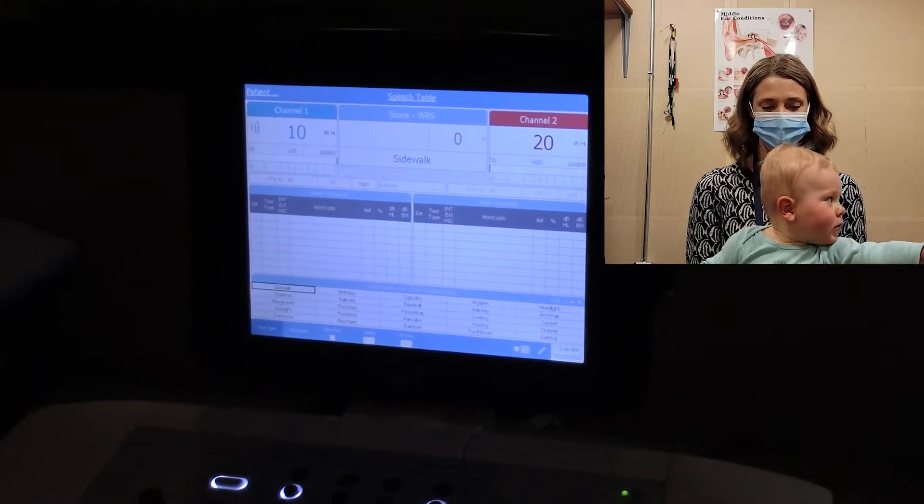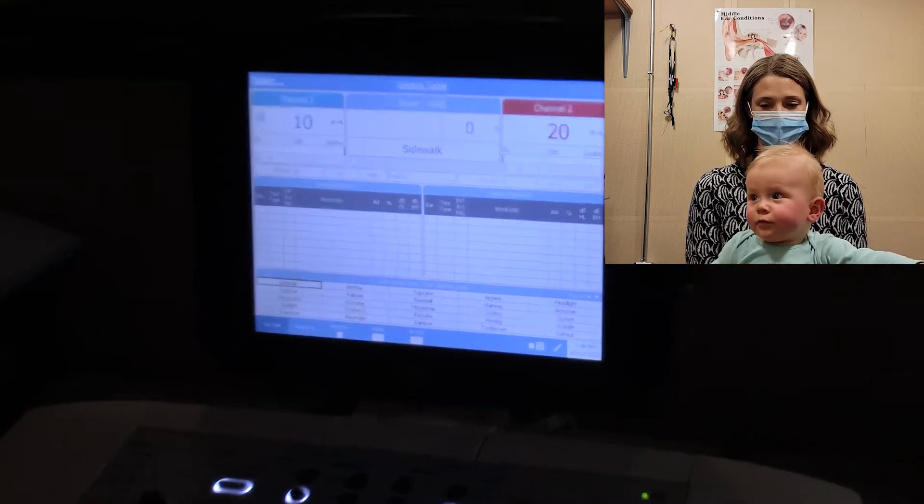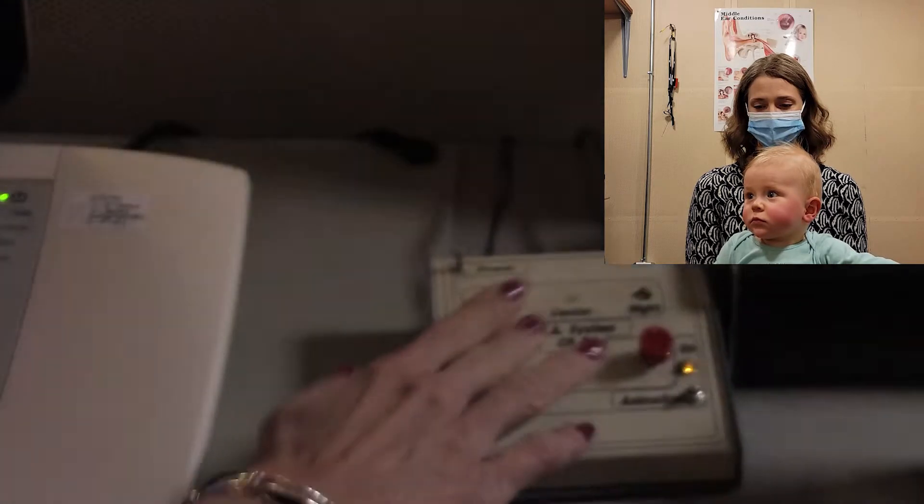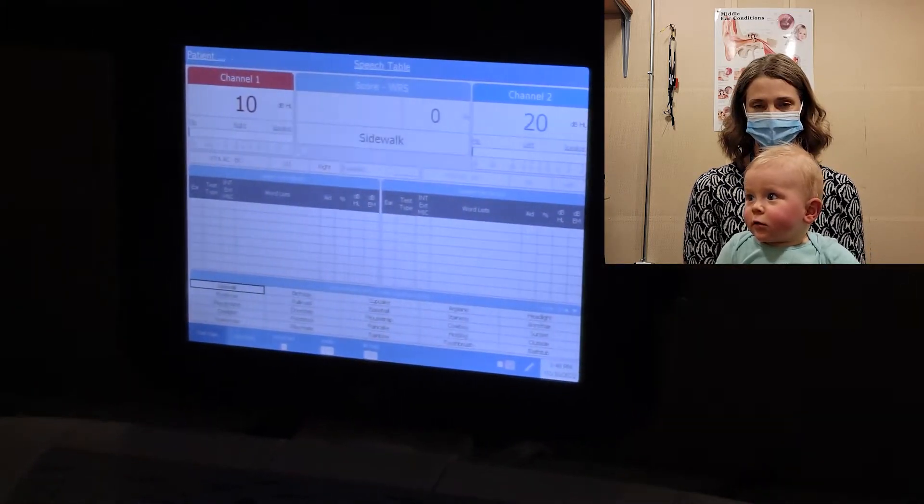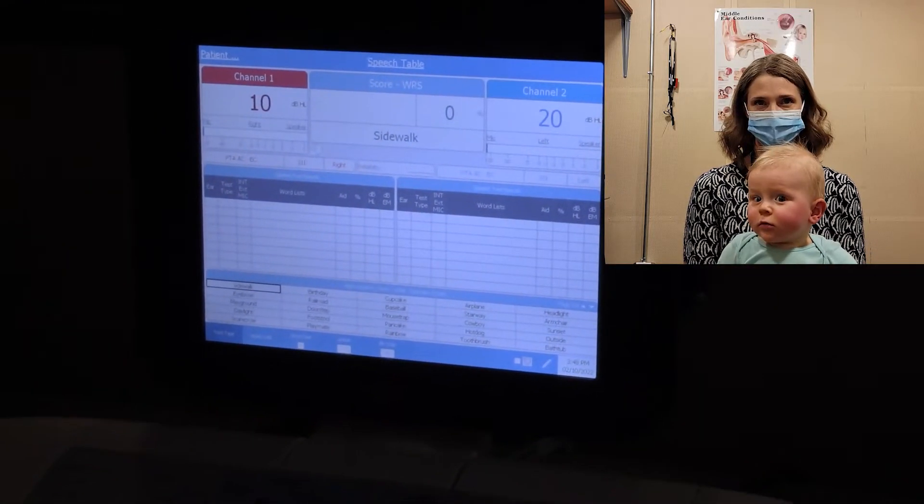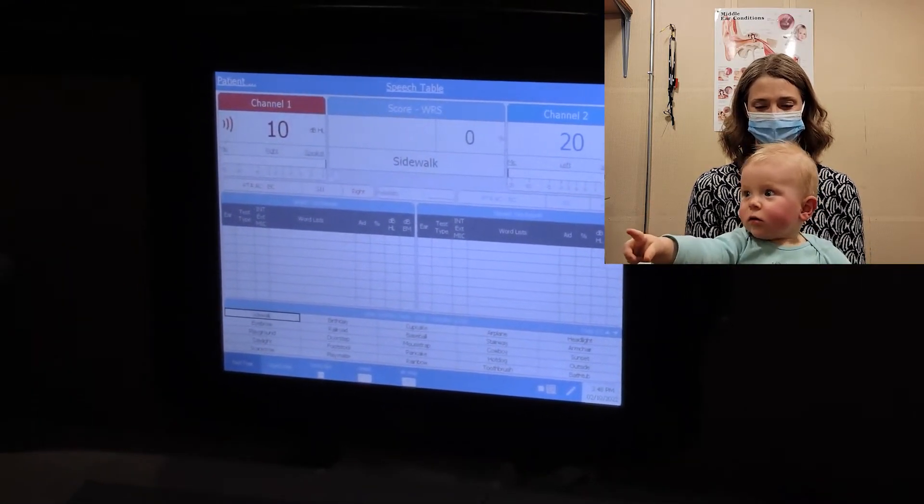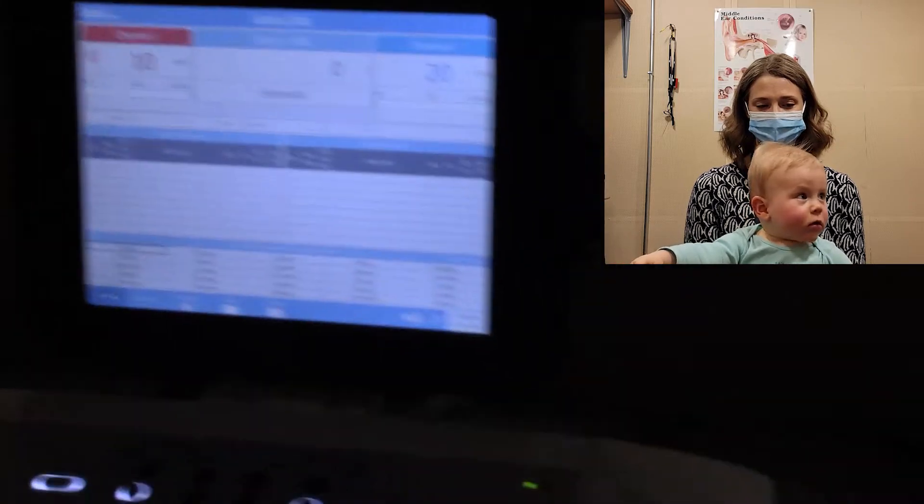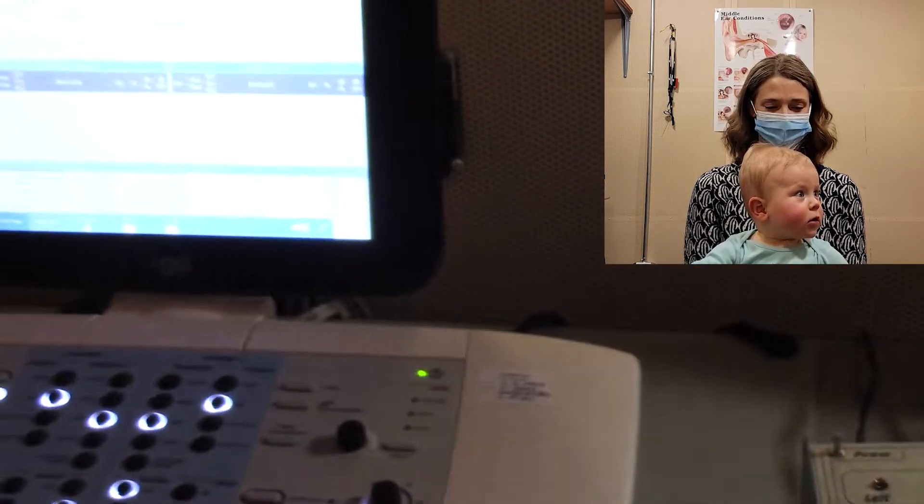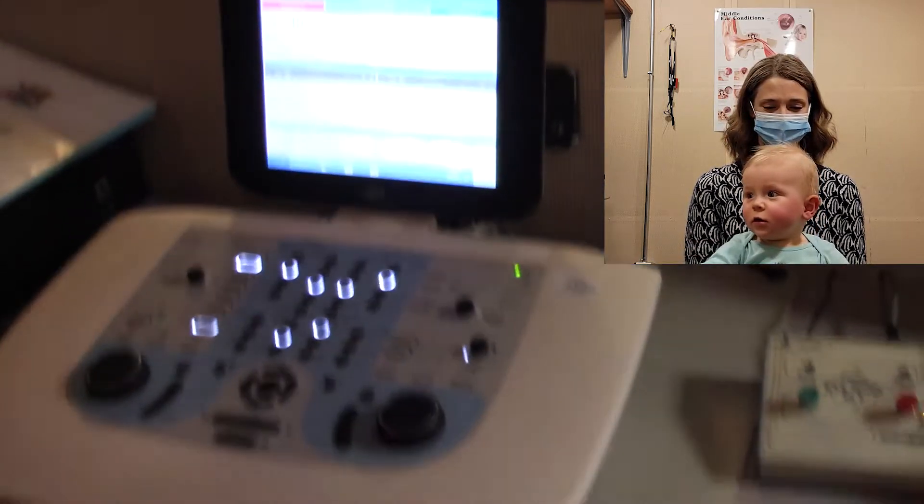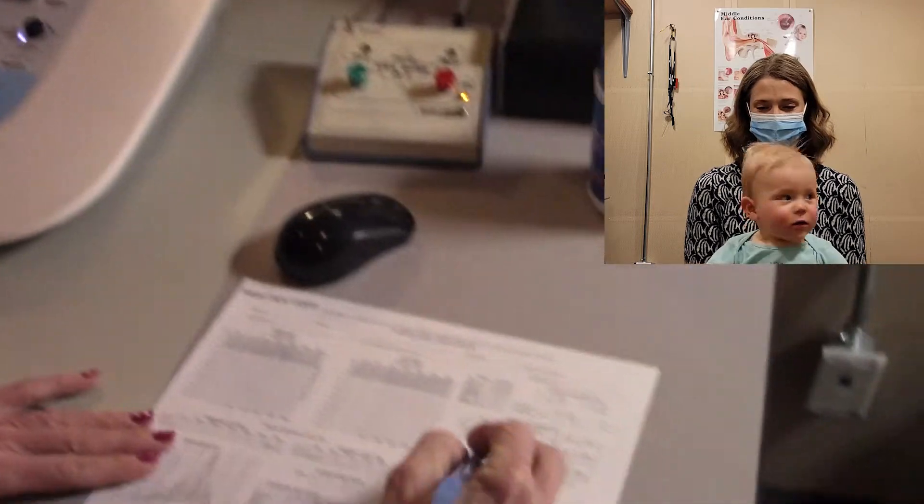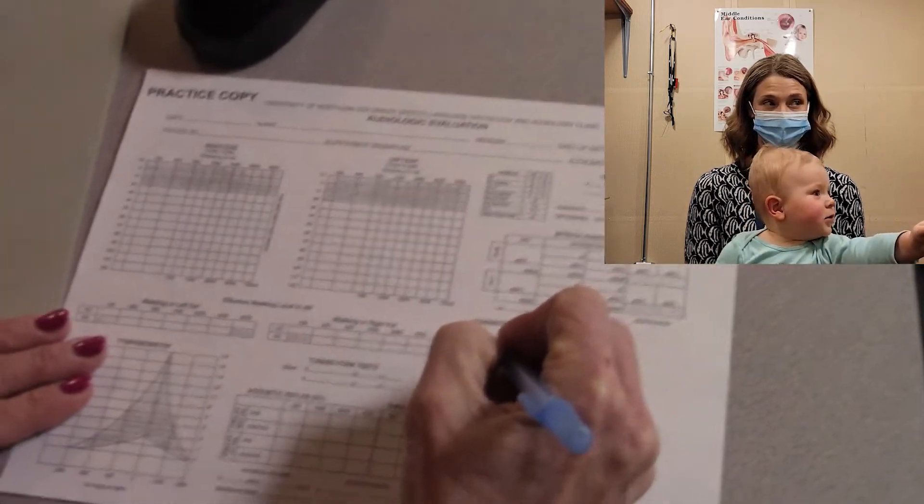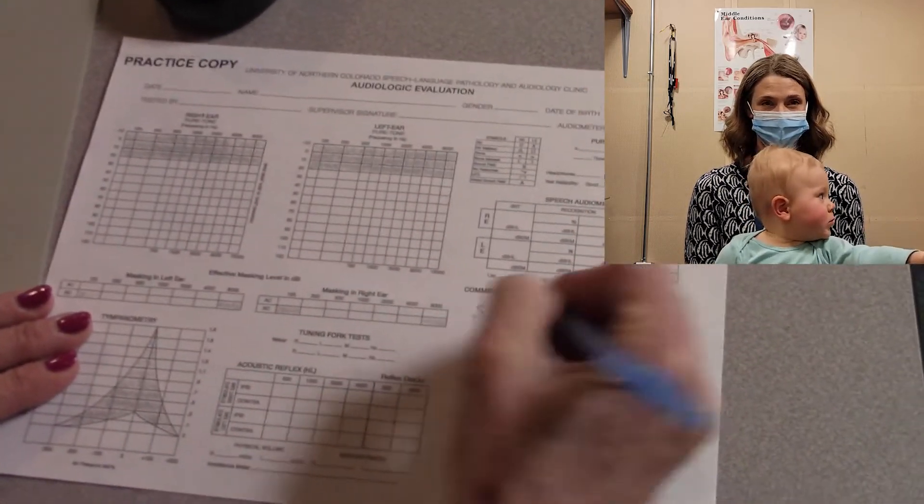Hello, hello. And then going back to the right. Oh, good job. I think I'm just going to take 10. Now, let's see. So, SAT.